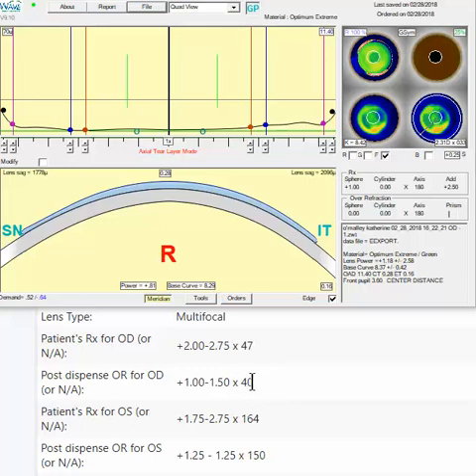If you have a significant difference in cylinder axis on the over-refraction, for example, if you're say 40 or 50 degrees off or even 90 degrees off on that, I would suspect that you have some compounded cylinder things going on here, and generally speaking, in those situations it creates a very complicated optical design, which often doesn't work so well in the end. So that's a little more thinking you have to put into that kind of design, and we could talk about that at a different time, but at least in this one you could be safe adding that in.